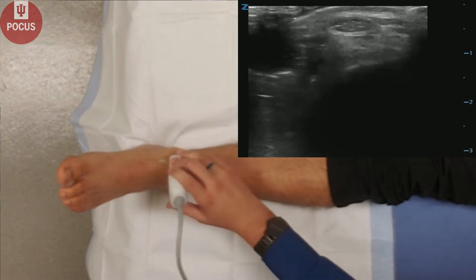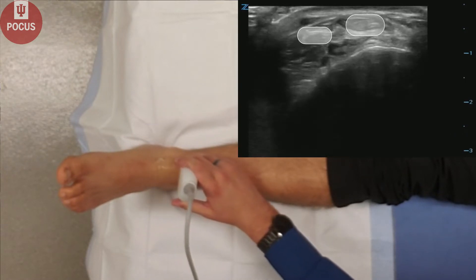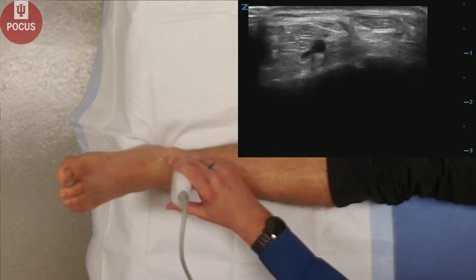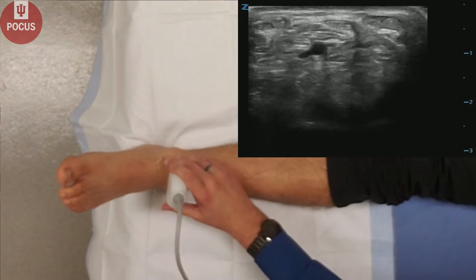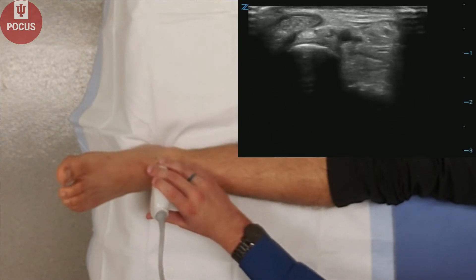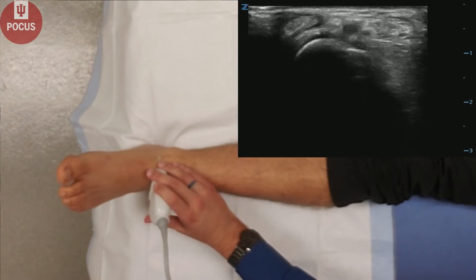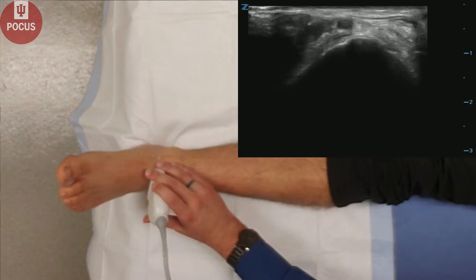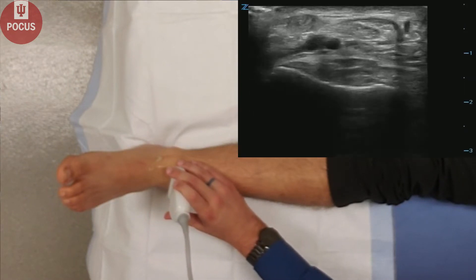Next, we'll look in transverse axis, and we can look at various tendons, the anterior ankle tendons. We can look at them in short axis, looking for any breaks or synovitis. You can follow them all the way down to their tendinous insertions. We can also look at the dorsalis pedis artery — make sure that it is patent, especially if you cannot palpate the artery.